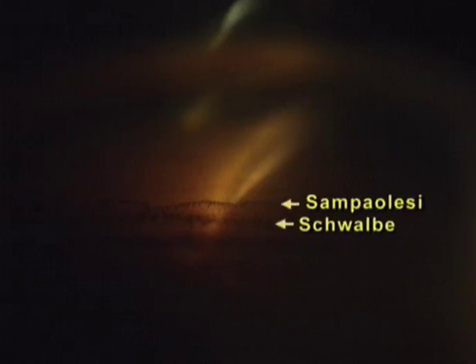Its position anterior to Schwalbe's line can be verified in optical section. When we follow the light slit on the outer and inner corneal surface, we see them coming together at Schwalbe's line, that is, behind Sampaolesi's line. Compare these outer and inner light slits in pseudo-exfoliation syndrome with those in this case of excessive pigmentation where they meet at Schwalbe's line in front of the pigment.